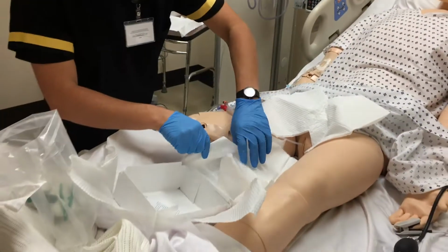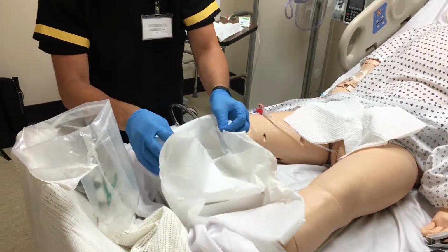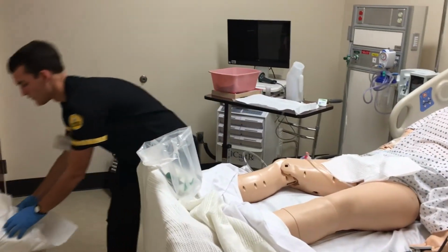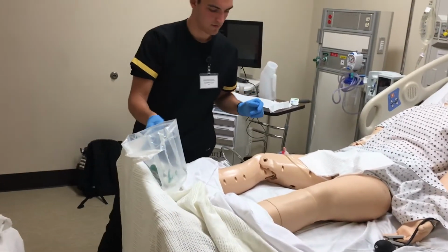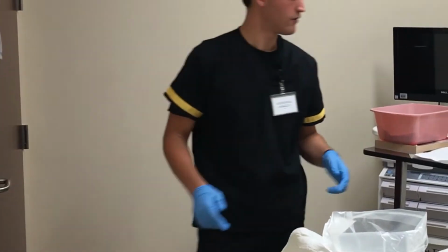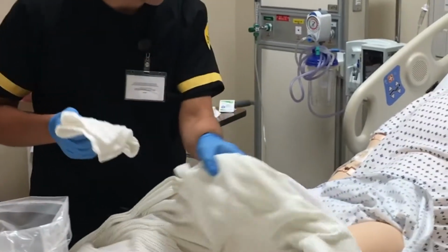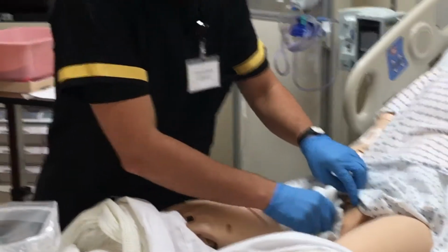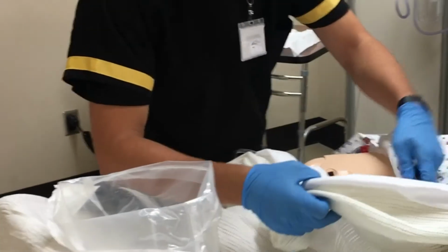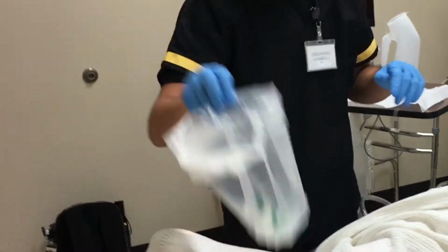Next, I'm going to clean this up a bit, and I'm going to leave. But before I go, I'm going to go ahead and remove the betadine that I have down here. Alright, now I'm going to get you in a comfortable position, and I'll be back in a little while.